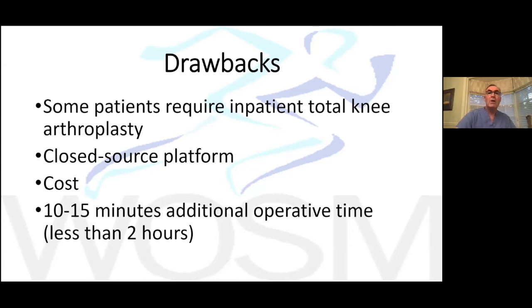Another drawback is that there's still a bit of siloing in this technology. These are closed source platforms, so that if one is going to use the DePuy computer and robot, it's specifically designed for DePuy implants.